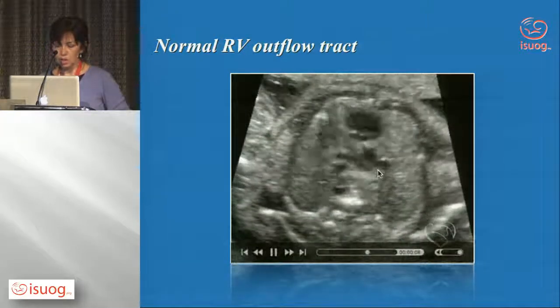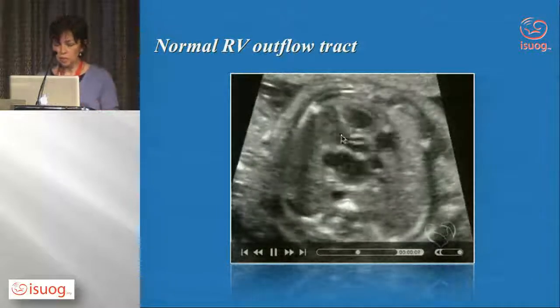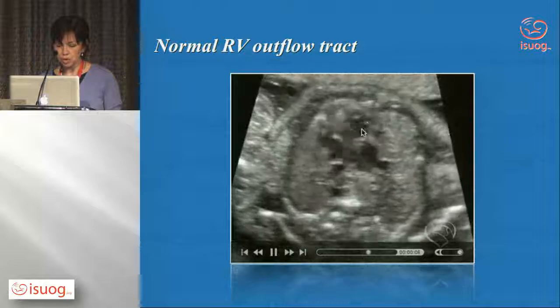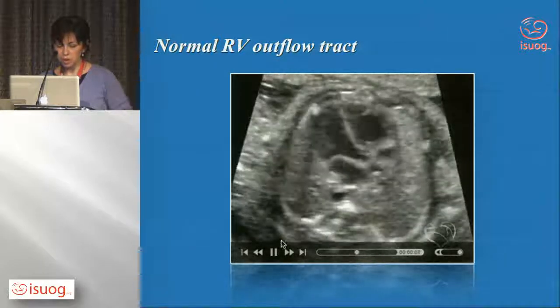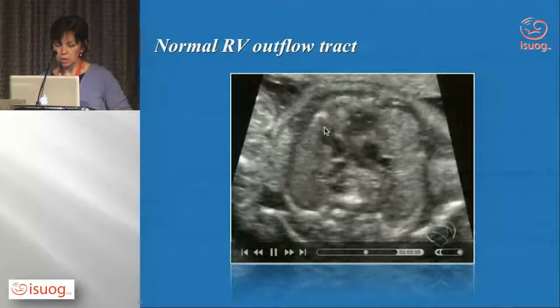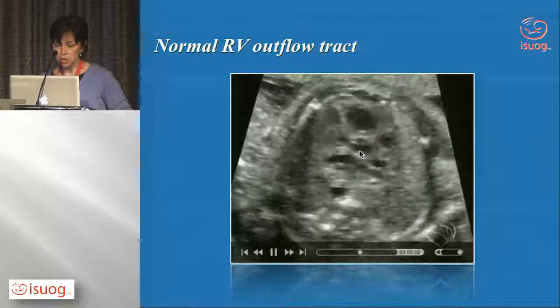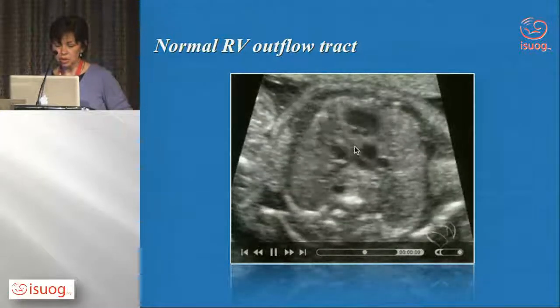So we still have here, the beginning of this clip is a very, very short clip, but we go from the left ventricular outflow tract to the right ventricular outflow tract, the pulmonary valve here opening and closing. We can see that crossover. So left ventricle coming towards the right shoulder, right ventricle coming across at 90 degrees at their origin.